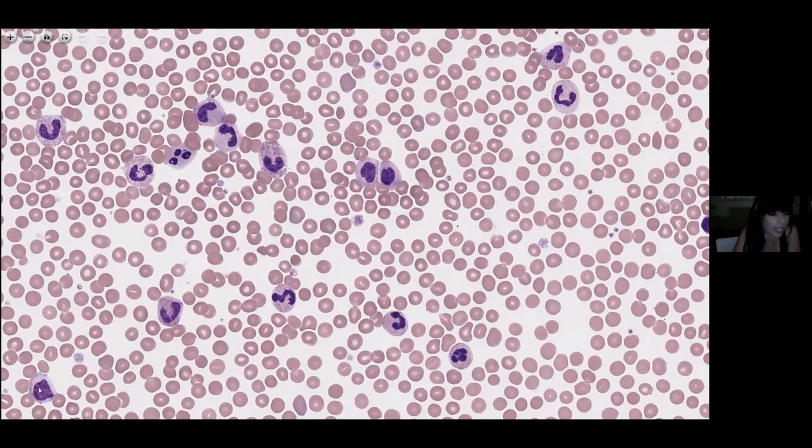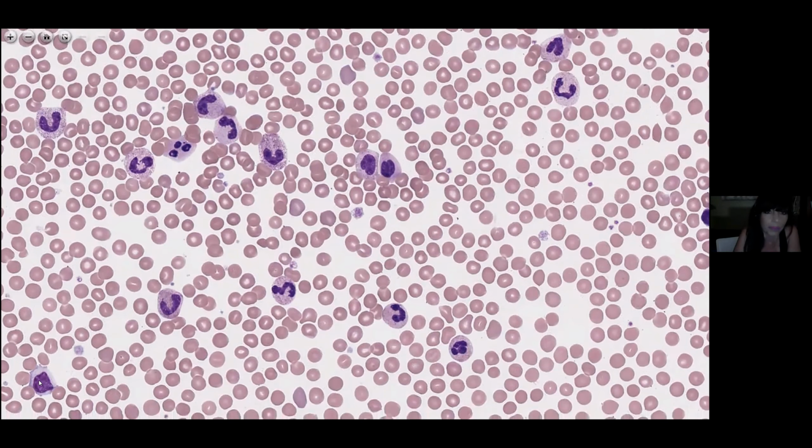So just coming back to this case, what would you do? You've got the blood count, so obviously it's abnormal, and we've correlated it with the clinical history that's just fatigue, and we assume there's no other clinical features to suggest a leukemoid reaction, things like infection, malignancy, growth factors, etc. Doesn't look like CML. What kind of things maybe should we be thinking about, and how do we take things further?